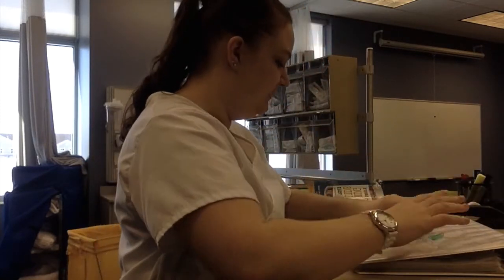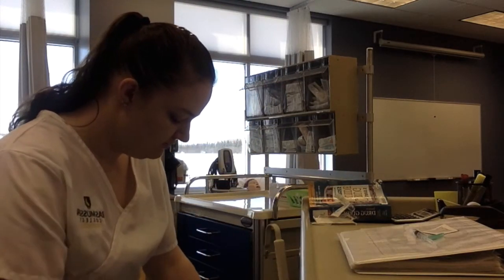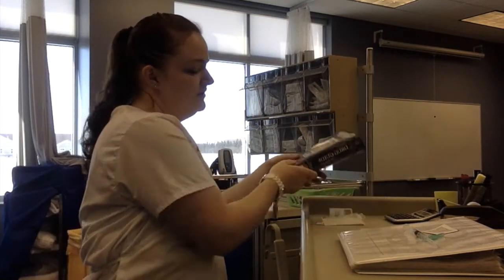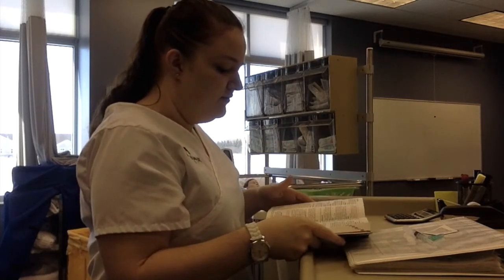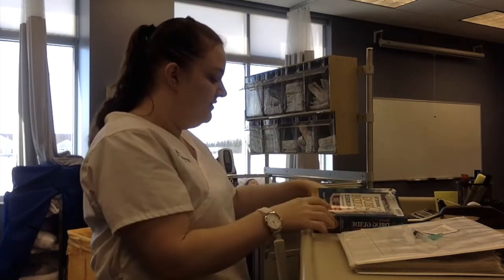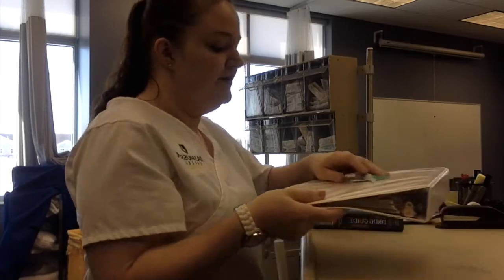Close my MAR, put my needle on top, gather another syringe, put my medication back for my third check. Naloxone, 0.2 milligrams per milliliter. After that, I would lock the cart and I would consult my drug guide. I would know that naloxone reverses excess opioid use and that it has to be given either as an IV or an IM injection. I would know that I'm giving an IM injection, and then after all my supplies are gathered, I would go to my patient's room.